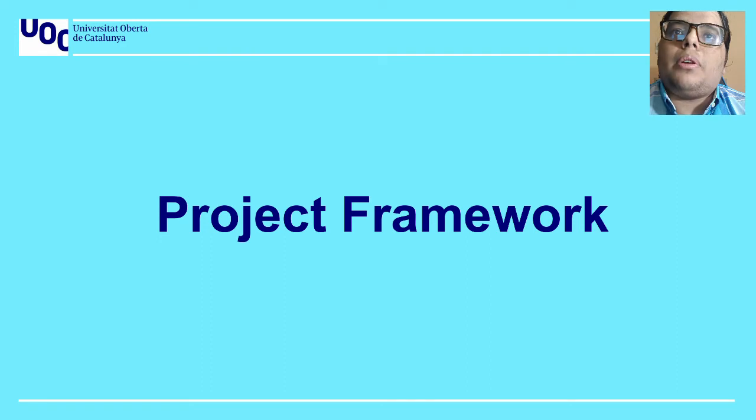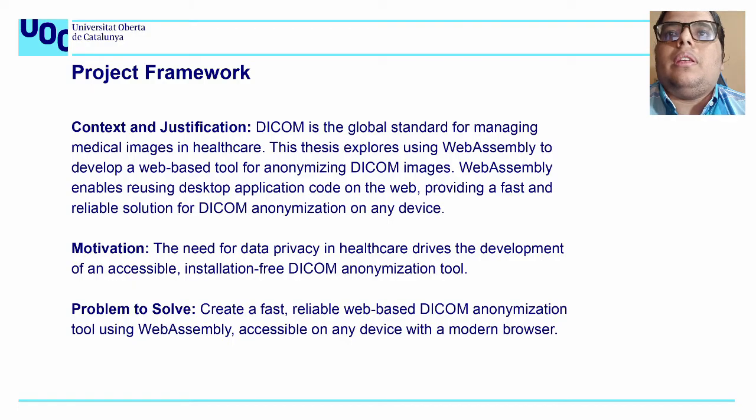In the project framework, we have the context and justification for the project. DICOM is a global standard for managing medical images in healthcare. So this thesis explores using WebAssembly to develop a web-based tool for anonymizing DICOM images.